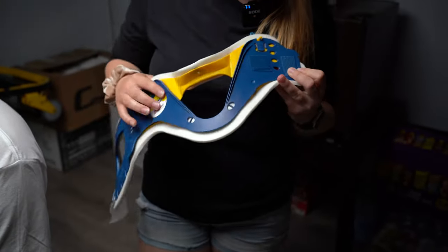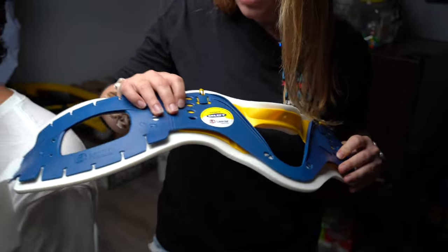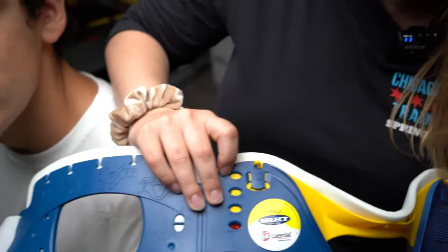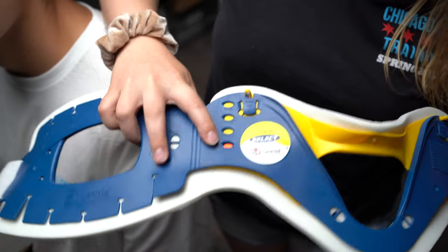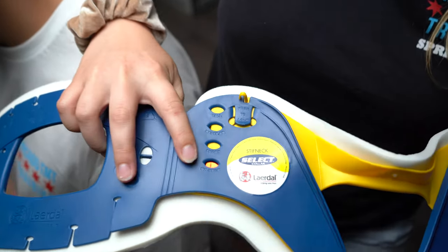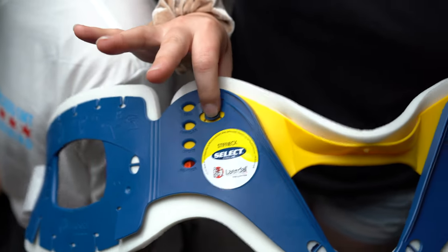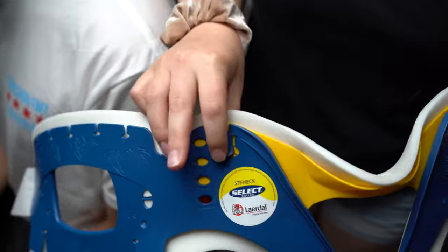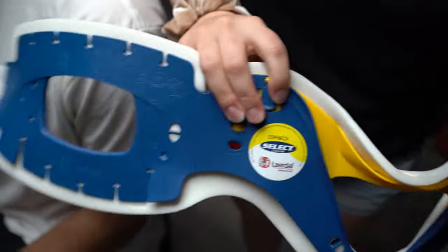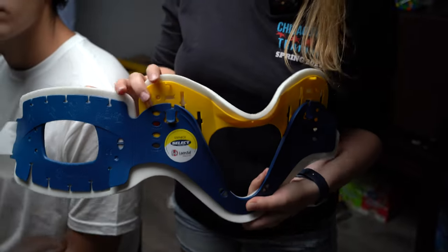There are different sizes: no neck, short, regular, and tall. The red dot here indicates where it's at — right now it's on no neck. There's a locking mechanism where you put your index finger on one side and your thumb on the back, and you can push forward to unlock or push down to lock. I'm going to unlock it so I can move it freely and pick the right size.